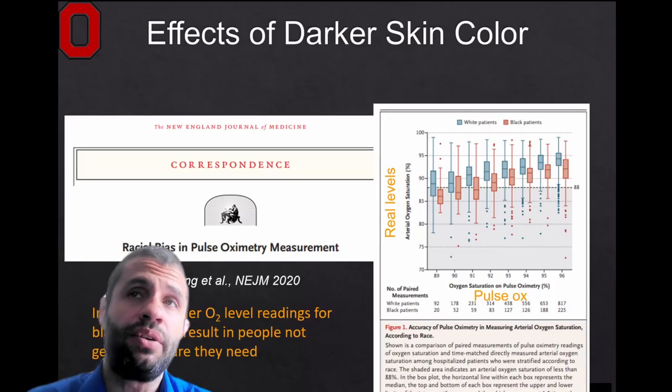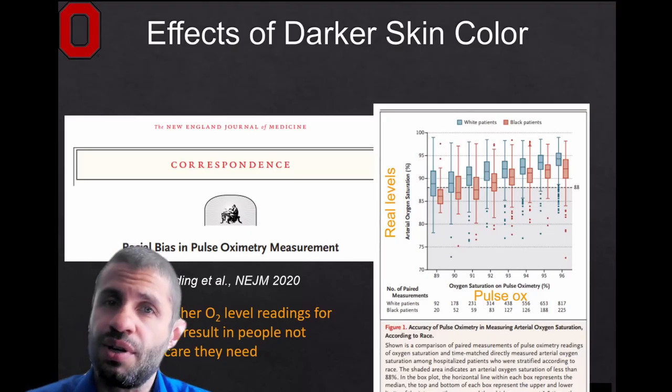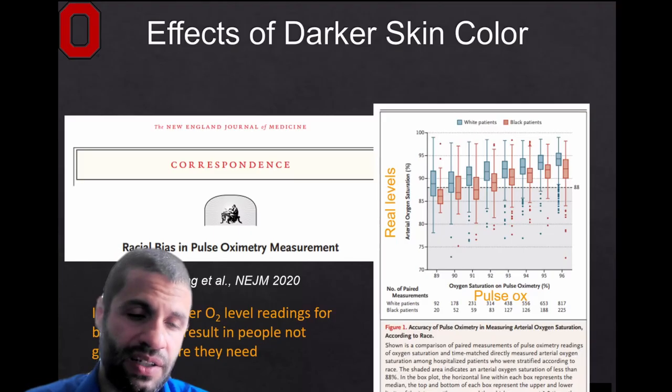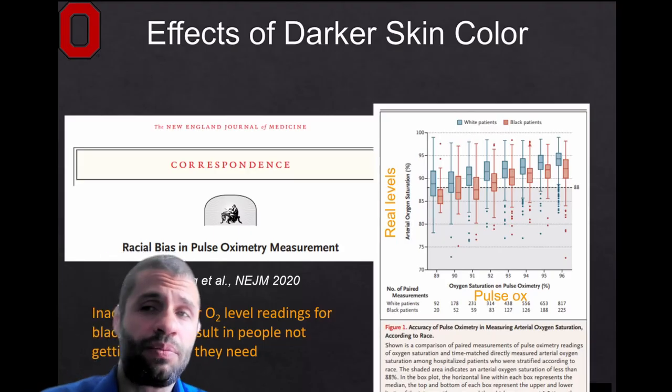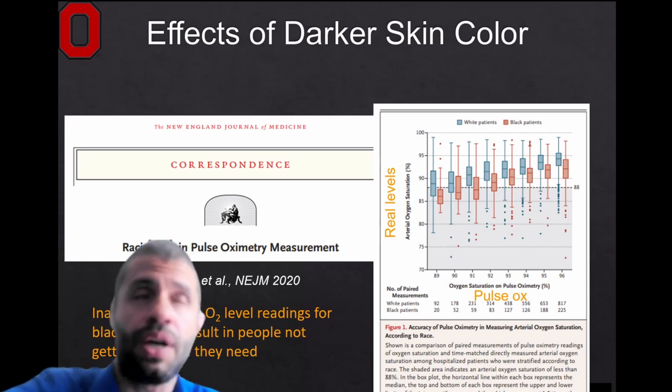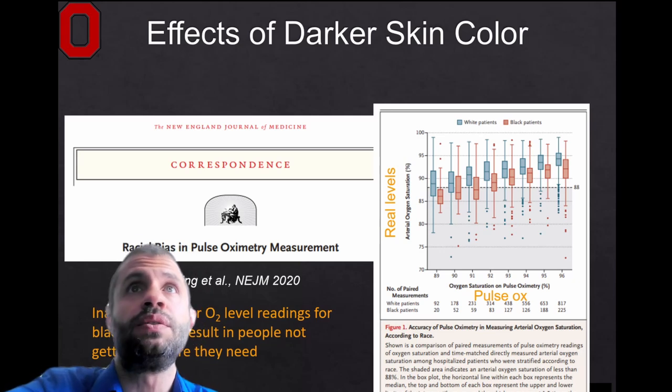So as an engineering problem, as a societal challenge, it's very important that we test pretty much everybody from one end of the spectrum to the other in order to make sure that we are designing, testing, validating, and calibrating our equipment with as much information as possible. And in the project, we're going to talk about a little bit of how we can do that through statistics and design of experiments.